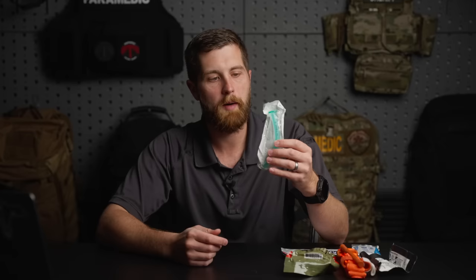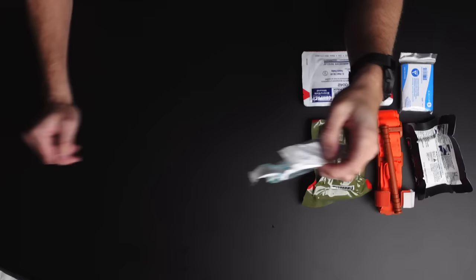Next up, we've got an NPA — nasopharyngeal airway. You can get one NPA for about $5 or $6, or you can get a variety of sizes for about $30. Size these to the people you are around. If this is a range kit and you're going out with guys your size who fit a 28 French, get a 28 French NPA. But if you're going out with your kids, size the NPA for them. 28 French is the standard in a lot of IFACs because most are built around a military model with 20-to-30-year-old fit guys, but that's not the case in your everyday life.